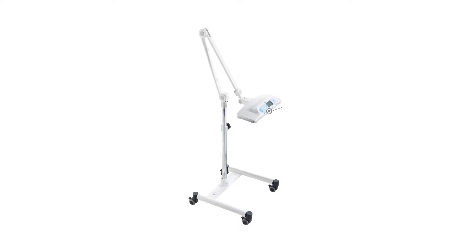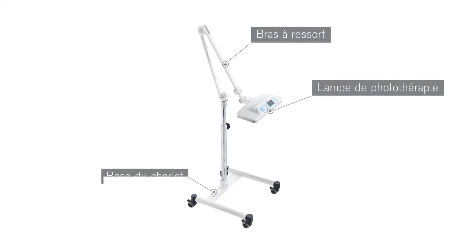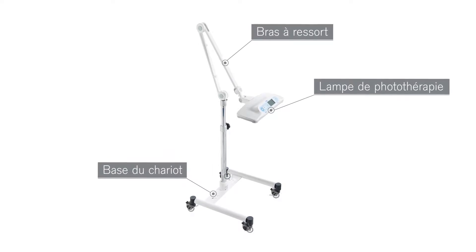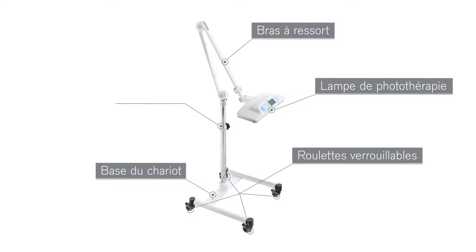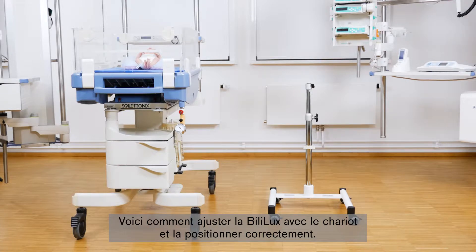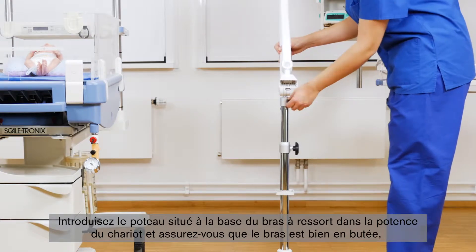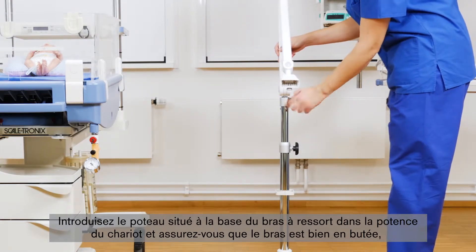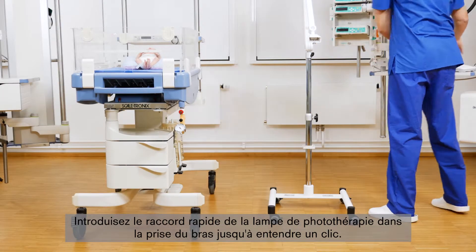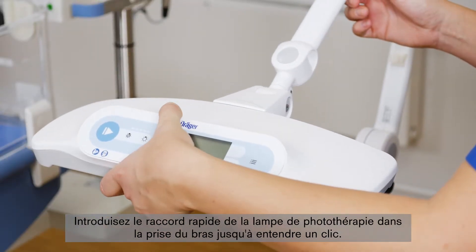The Bililux with trolley consists of the phototherapy light, an adjustable spring arm, and a rolling trolley that allows flexible use above an incubator, radiant warmer, crib, or bassinet. The trolley itself has four locking casters and a height-adjustable pole. Insert the post on the bottom of the spring arm into the trolley pole and ensure that the arm is seated properly. Then tighten the tightening knob on the trolley to secure the arm. Insert the Quick Connect plug on the phototherapy light into the arm socket until it audibly clicks into place.